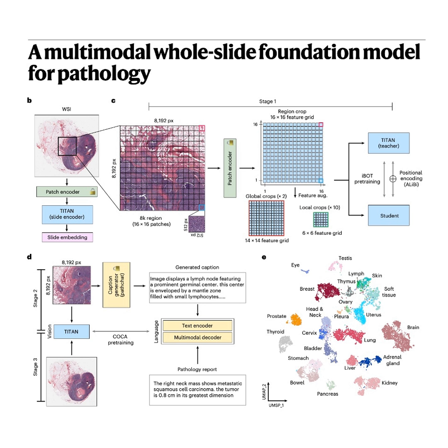Tiny. And traditional deep learning just falls apart when it can't generalize from that few examples. Exactly. So that's the mission for this deep dive. We're trying to understand how one specific foundation model aims to solve both problems at once: scale and scarcity. And that model is Titan, the transformer-based pathology image and text alignment network. This is a multimodal whole slide model, and it's designed to create a universal, general-purpose representation of any slide right out of the box. Without all that painful task-specific fine-tuning.